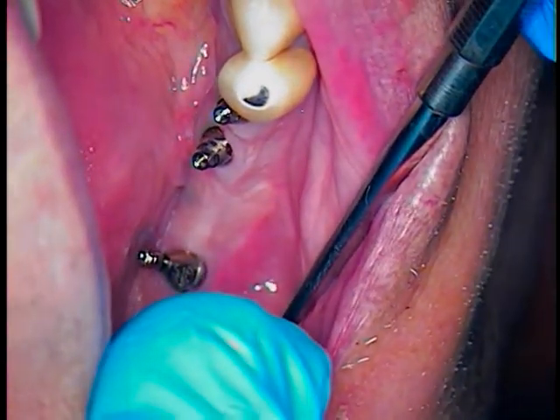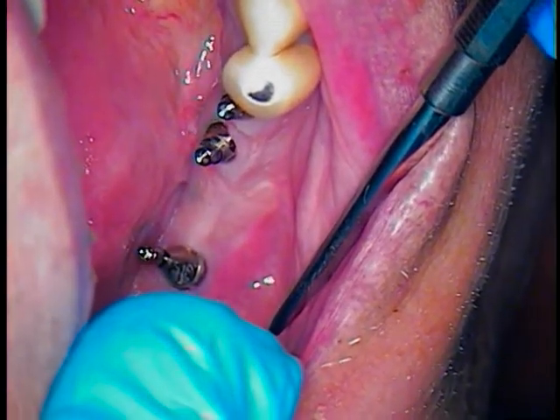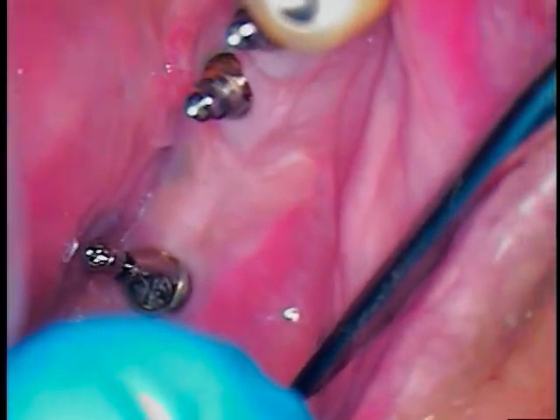Welcome back. We have the angled abutment in now and we're ready to wrap things up. I'm going to go to 5 power and come right back in.